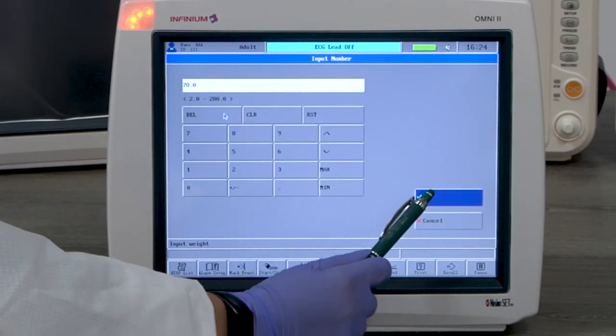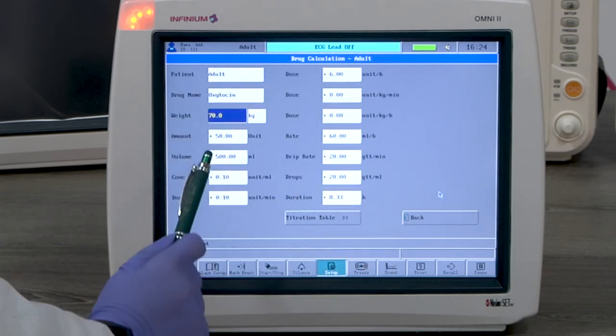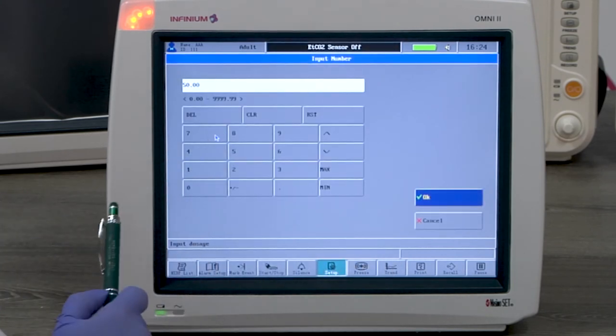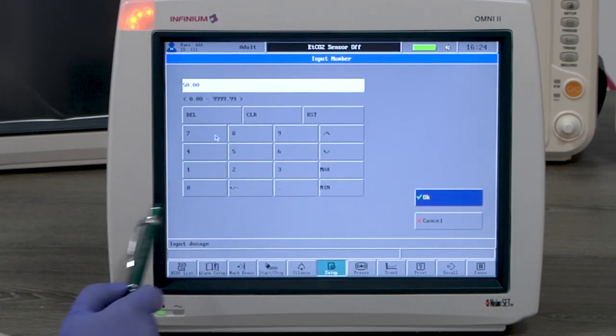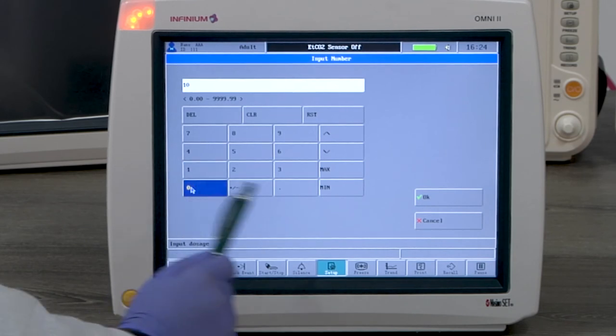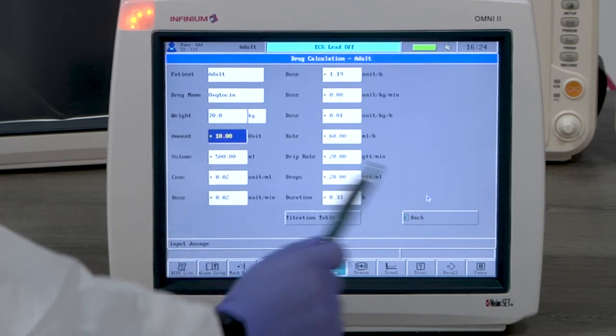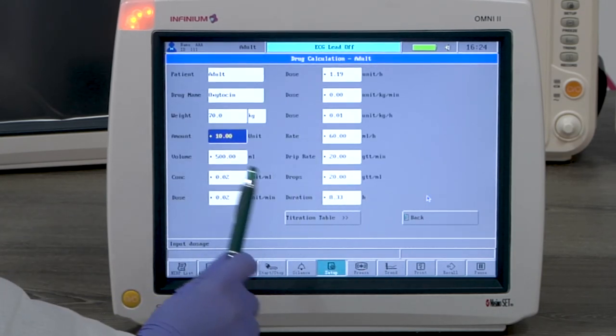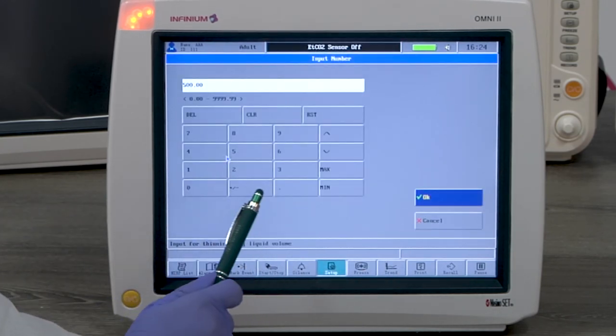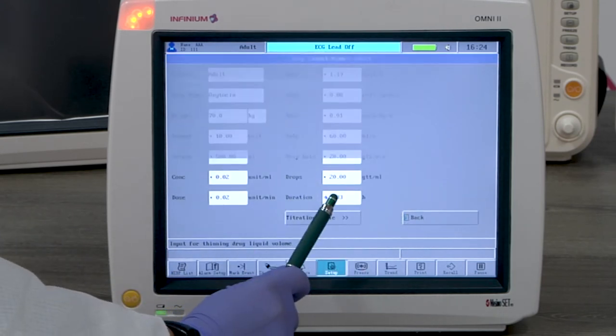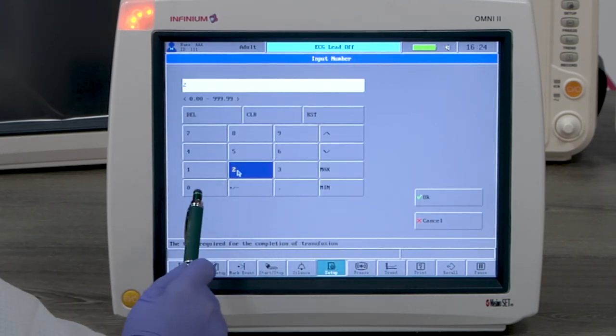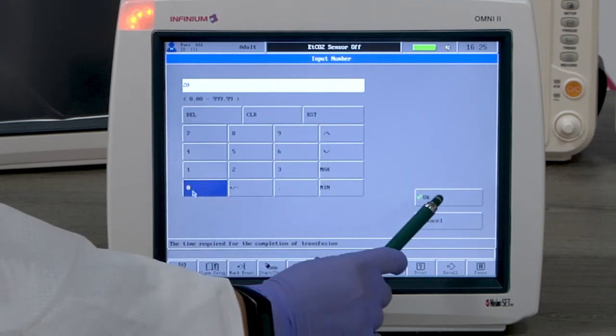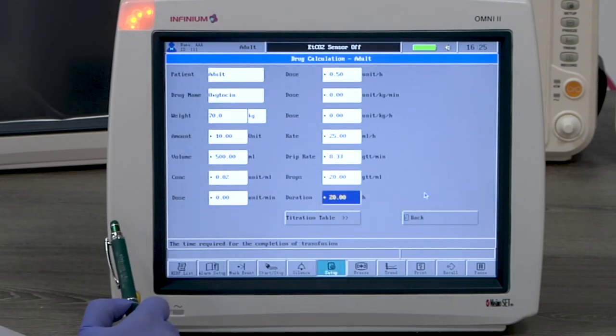Put in the weight. Here we use 70 kilograms as an example. Put in the total amount of the drug needed. We will use 10 units as an example. Put in the volume. Here we'll use 500 milliliters as an example. Put in the duration. We can use 20 hours as an example.